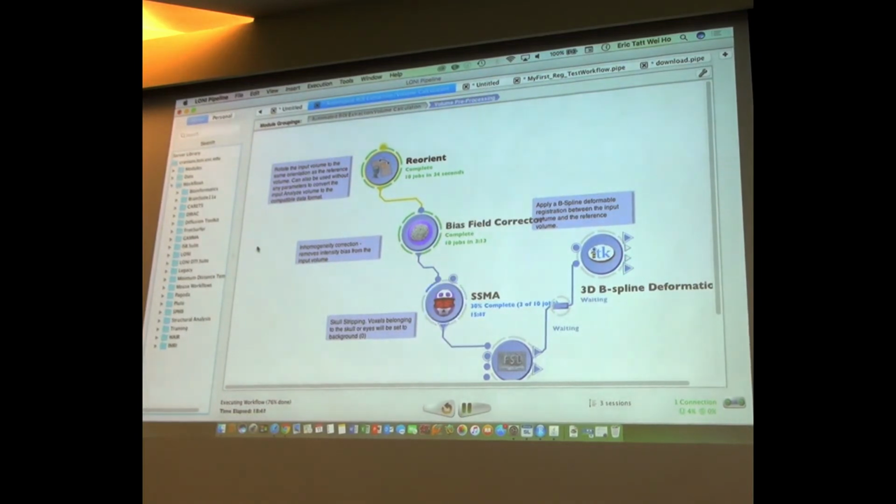Yeah, it doesn't really matter how many images because they go in parallel. That's one of the beauties of the pipeline workflow. It's just that the individual, you see, skull stripping is going to take 30 minutes. Why? Because it's a difficult process. The tissue gets connected, and the decision making of where to cut it, brain and non-brain, is complicated. So many of these things do take a little bit of time.